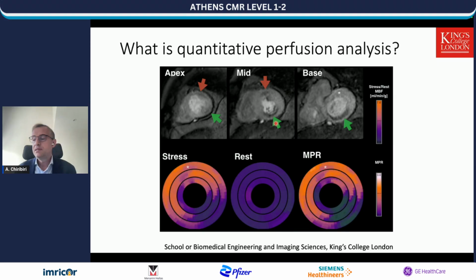And I think that's the main advantage of stress perfusion CMR compared with stress echo, which is instead relying on administration of high-dose dobutamine stress, in that we can actually provide a stratification of ischemia across the 3 coronary arteries, and we do not have to stop the stress when the first and more severe, more evident perfusion defect appears.